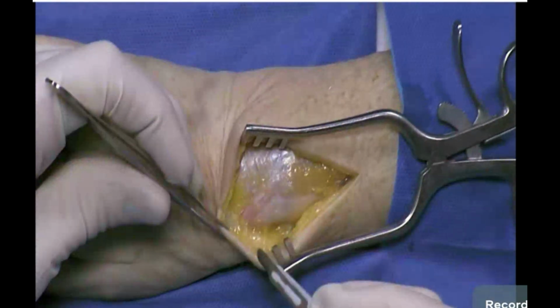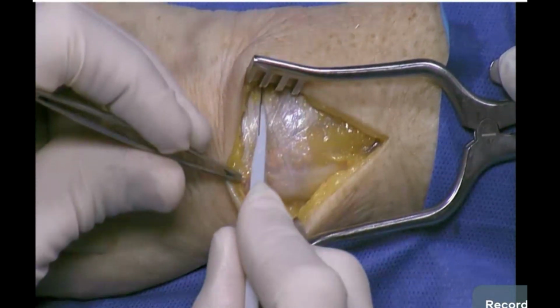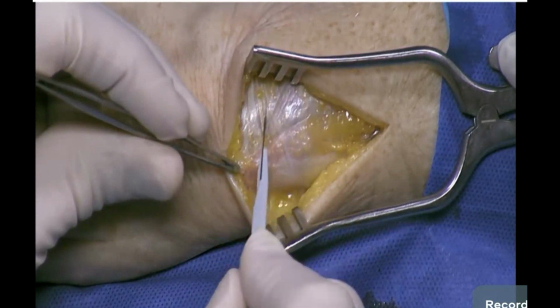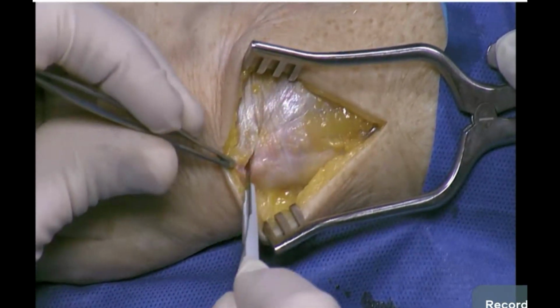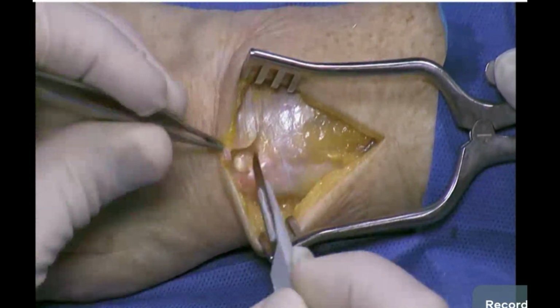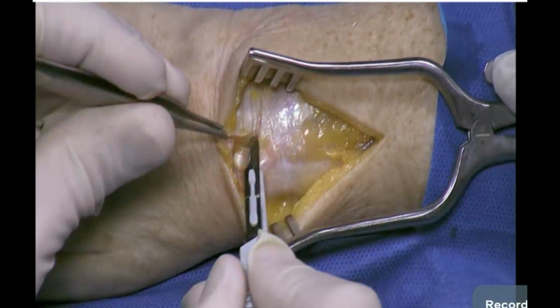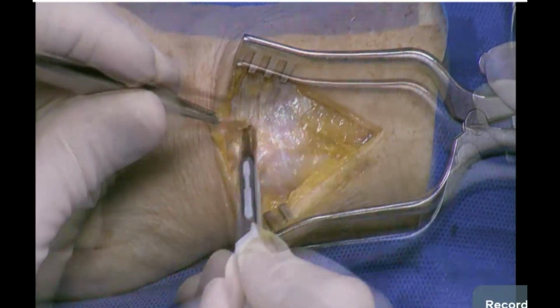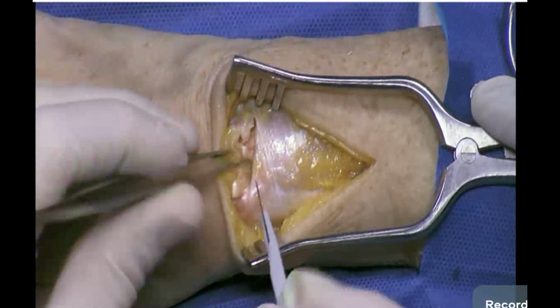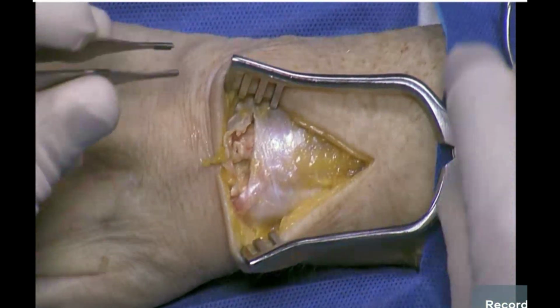And the extensor pollicis longus is a useful landmark as that exits the retinaculum, and then bring an incision straight over the retinaculum out the extensor pollicis longus. And then a portion of this flap can be elevated depending on the fracture. If one needs wide exposure to the joints, this can be elevated off of the fourth dorsal extensor compartment, or sometimes left on for an extra-articular fracture.